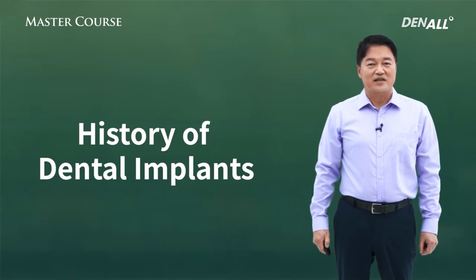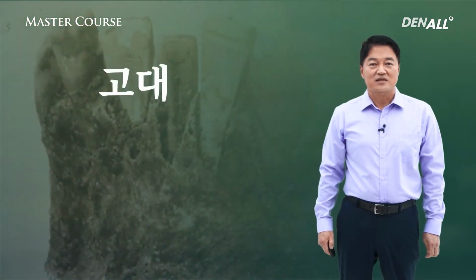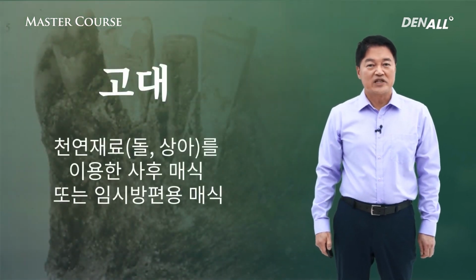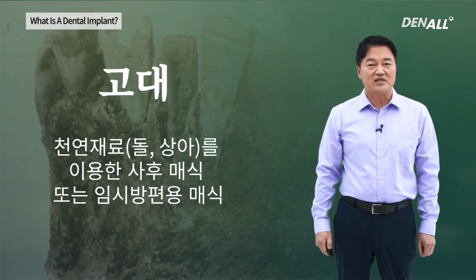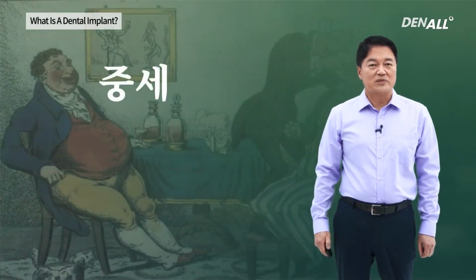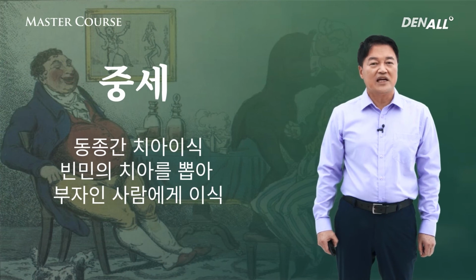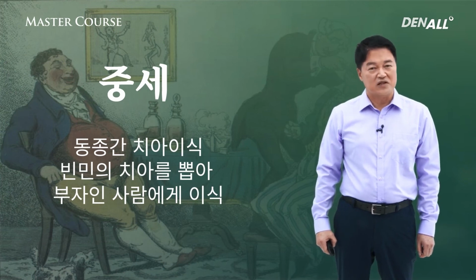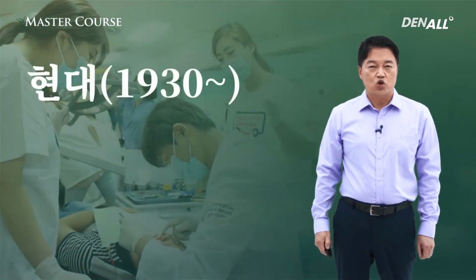History of dental implants. Let's look at them briefly. In the ancient days, rock and ivory was used, on the dead or as a temporary measure. In the medieval days, it's kind of funny, but tooth from another person. In other words, a tooth of a poor would be taken out and would be transplanted on the rich. In my opinion, I think it had very low success rate.